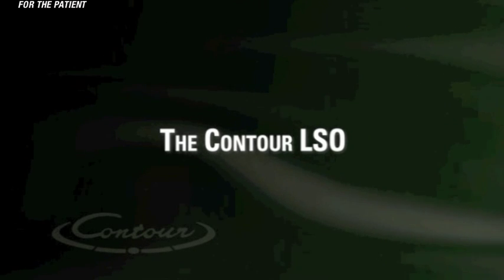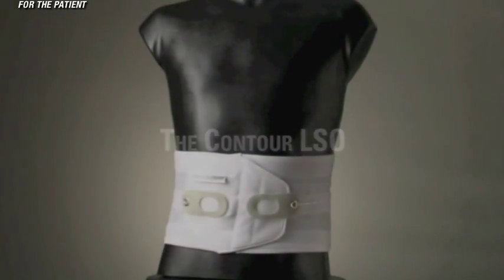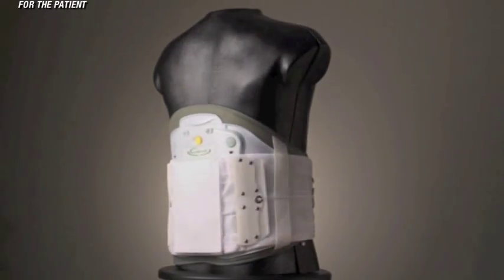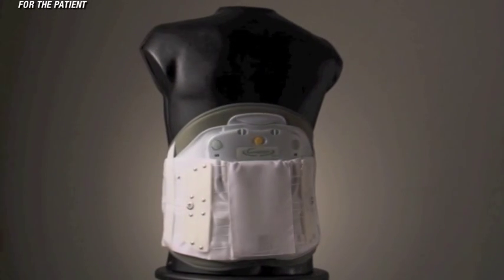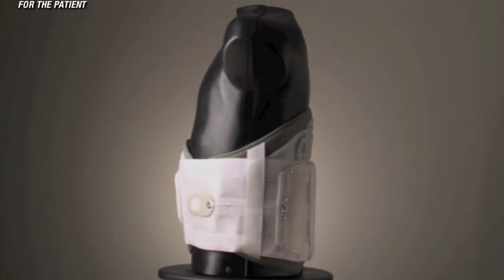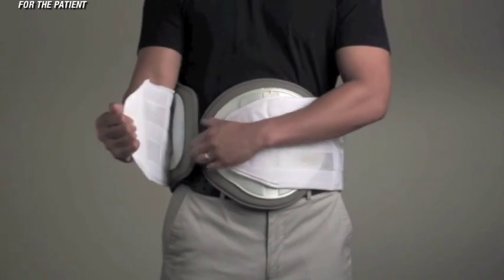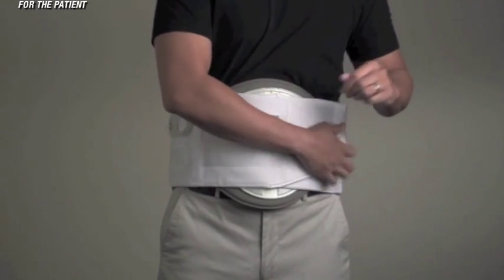The Contour LSO. When additional support is needed, the Quickdraw steps up to a Contour LSO. Application of the Contour LSO is very similar to the Quickdraw, and again, there are three main elements to remember when applying. Apply tightly — in order for the brace to work properly, it must be applied tightly.